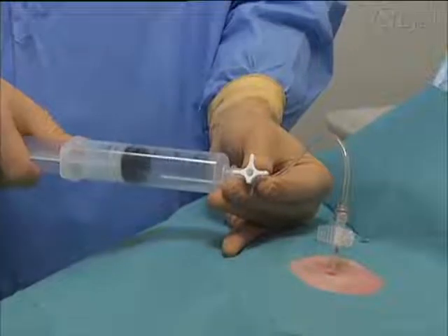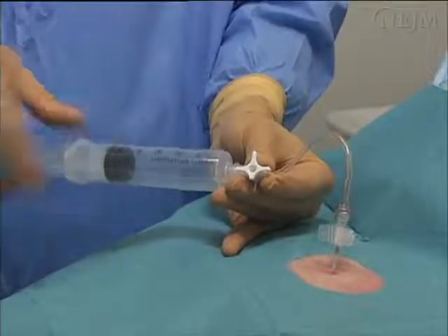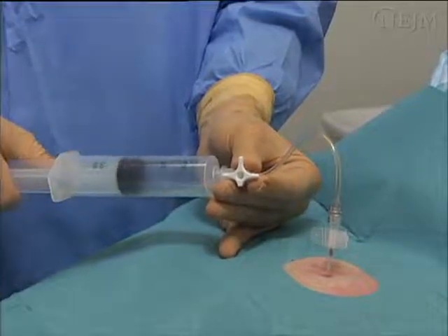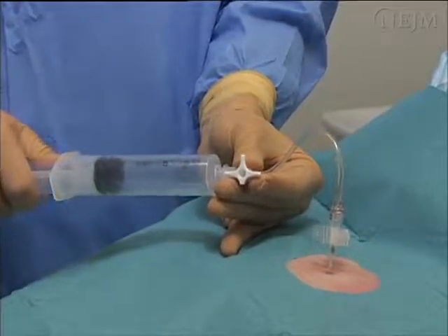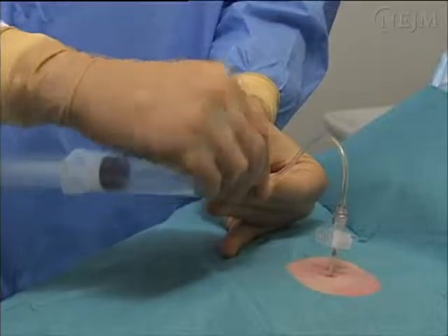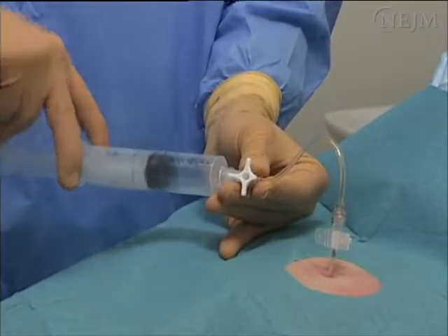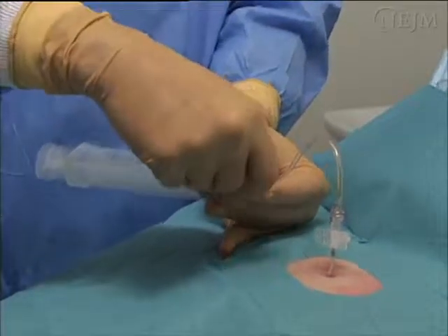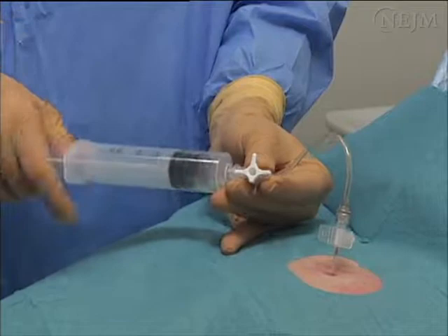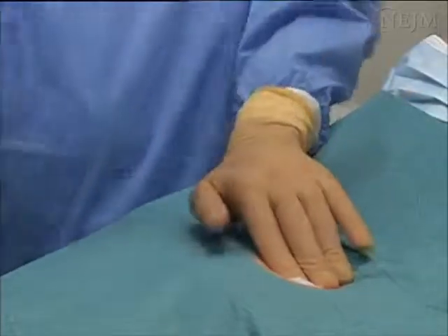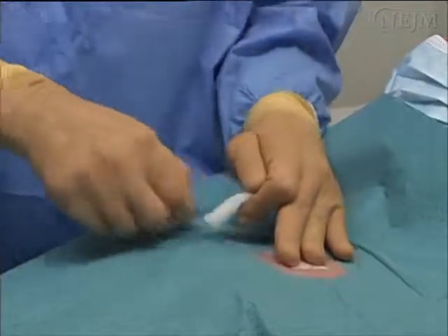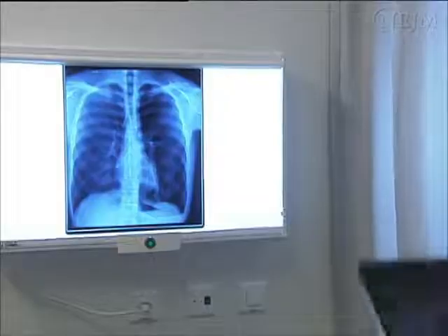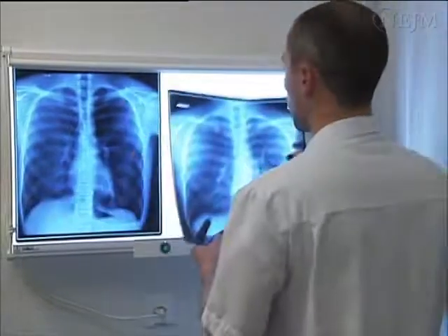Measure the volume of air aspirated by counting the number of syringes evacuated. If more than 2.5 litres have been evacuated, the procedure should probably be stopped, as such a large volume suggests an air leak. Continue manual aspiration until you cannot aspirate any more air. Remove the catheter, put a sterile dressing on the site of insertion, and order a post-procedural chest radiograph with the patient in an upright position.